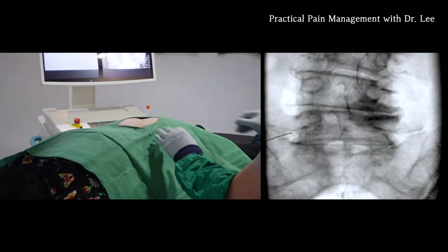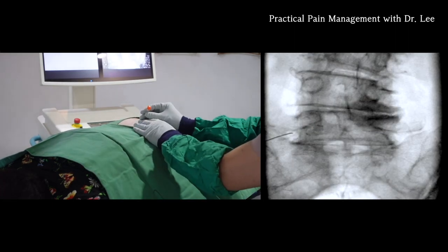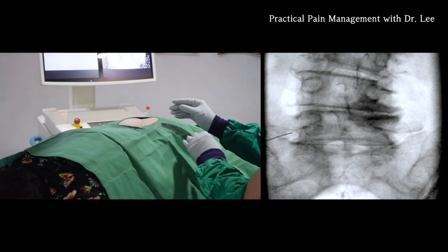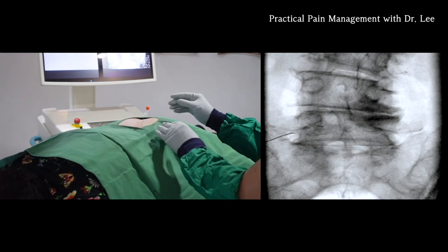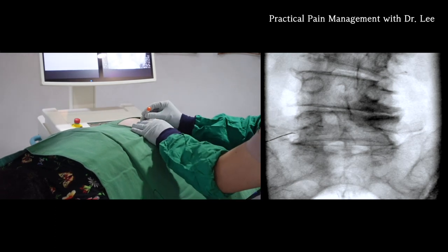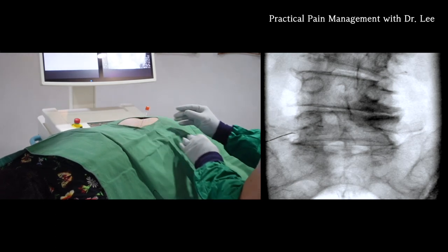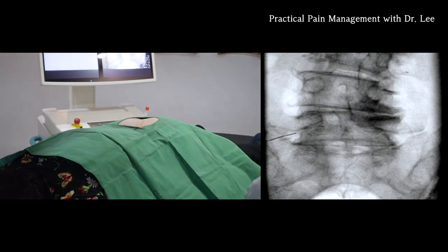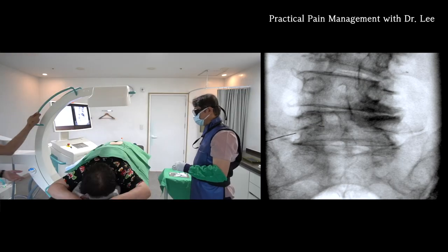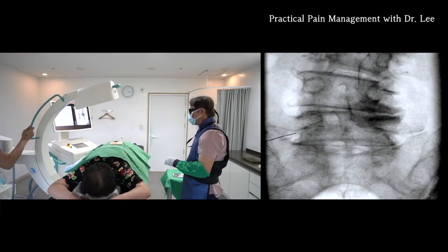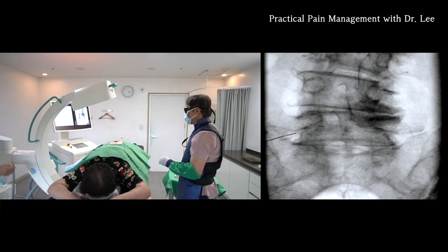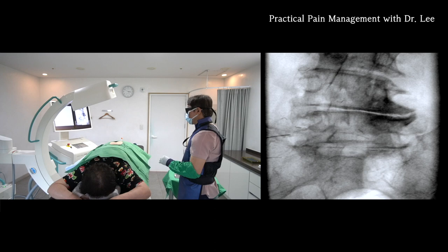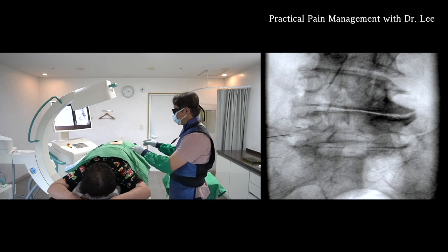Give me an AP view. She is expressing electric sensation, so I have to change the direction.